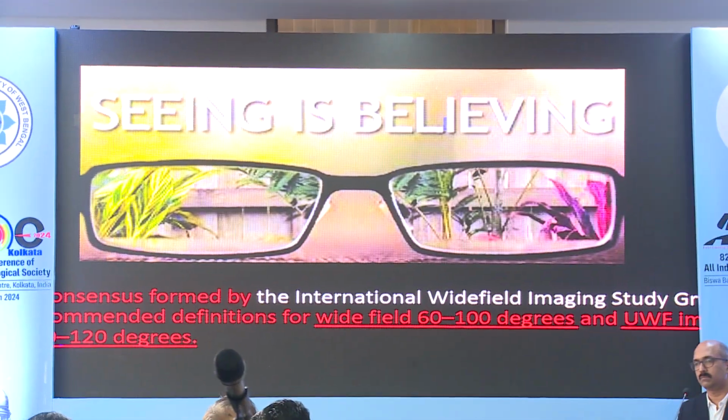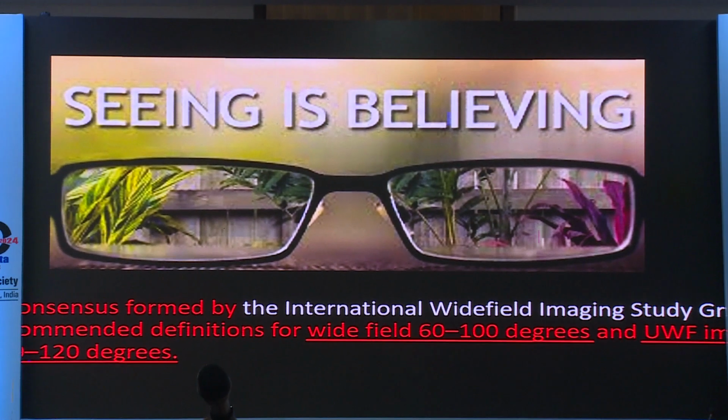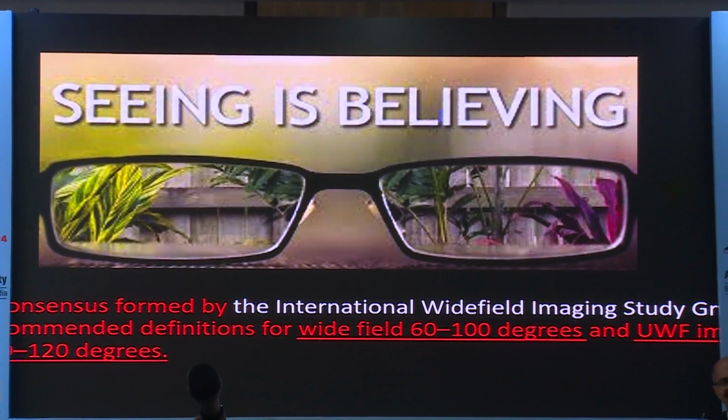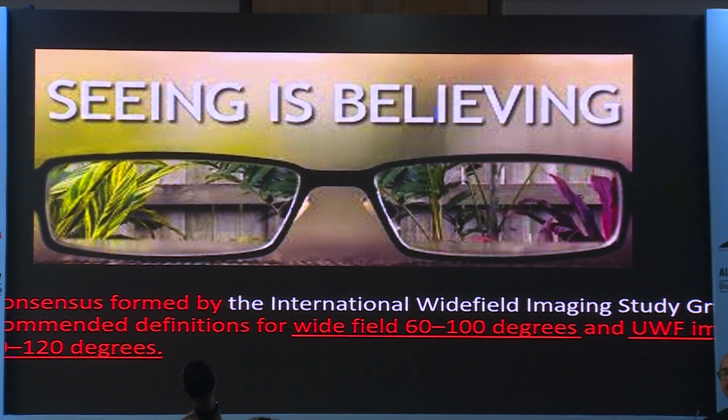I think Dr. Ajay Arora already told us that Dr. Ailo's group has defined the International Widefield Imaging Study Group recommended widefield to be 60 to 100 degrees and ultra-widefield to be about 110 to 120 degrees. And seeing is believing. Till you see it, you can't believe it, you can't treat it. And I love the acronym of Dr. Shane, that DREAM. Till we document it, educate our patients, and reinforce it, we cannot treat the pathology and cannot convince our patients to get treated. That's an amazing tip from today's talk from him.